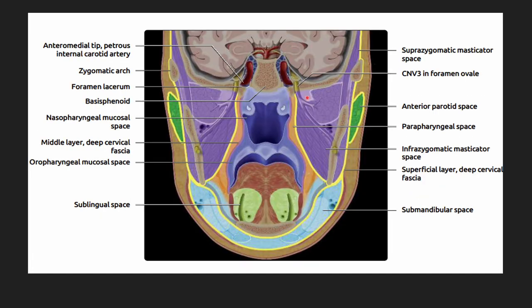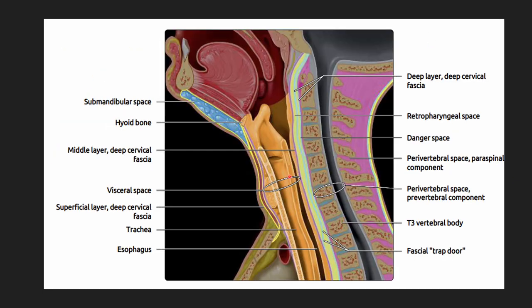On both sides we can appreciate the posterior cervical space which has fat as its component. Coming to the coronal section, this is our masticator space. Here we have the temporalis muscle and the parotid space, and in the anterior reach we have the submandibular space and the sublingual space which are better appreciated in coronal images only. This is the sagittal image where we can appreciate the middle layer of deep cervical fascia enclosing the retropharyngeal and the danger space. Posteriorly we have the perivertebral space with the paraspinal and prevertebral space as its components.